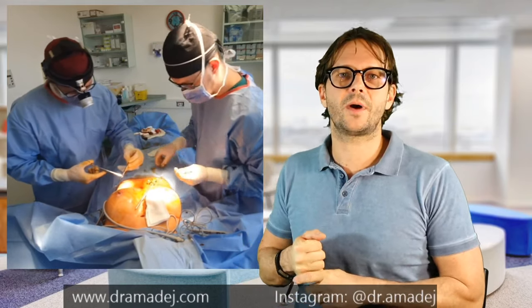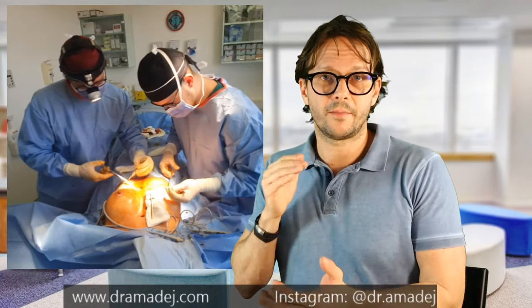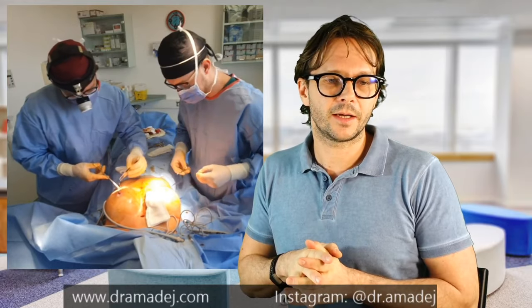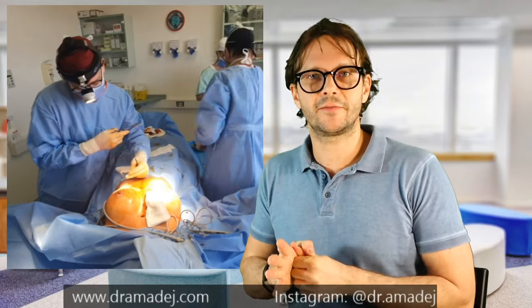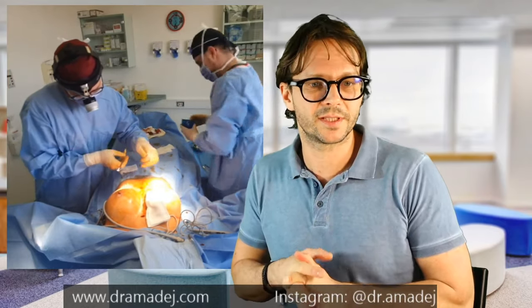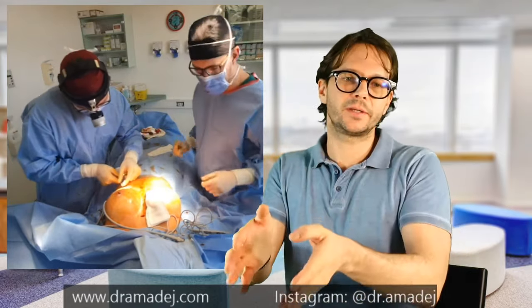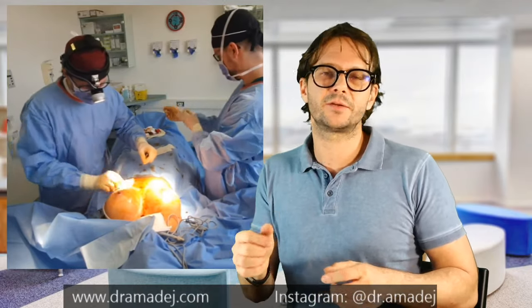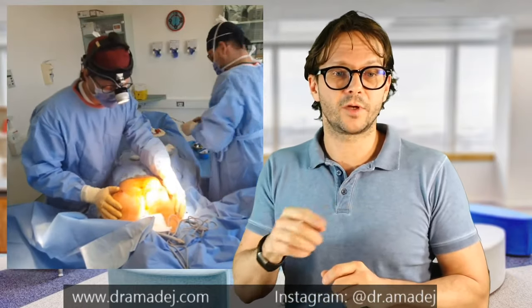Otherwise the pain is quite manageable with all these measures: a lot of local anesthesia and a good pain-killing regime after surgery. We start with painkillers during surgery and continue afterwards. As you can see the patient is completely anesthetized — she's in deep sleep. This is the safest way to do this surgery; we never do it under local anesthesia only. The anesthesia doesn't need to be very deep because we're dealing with superficial tissues — we're not entering the stomach or chest. After the procedure the patients wake up immediately and walk out of the operating room by themselves.